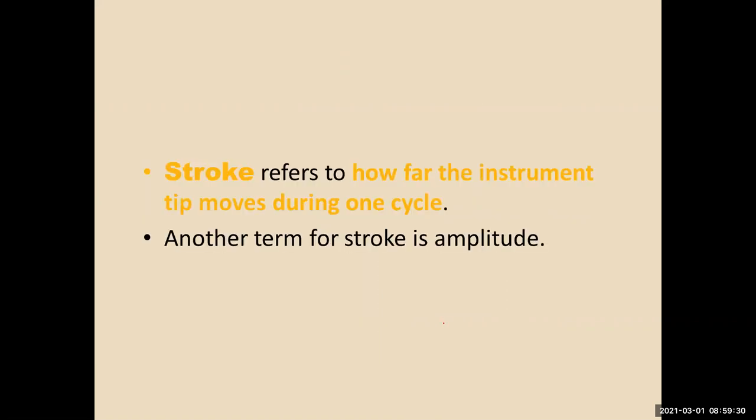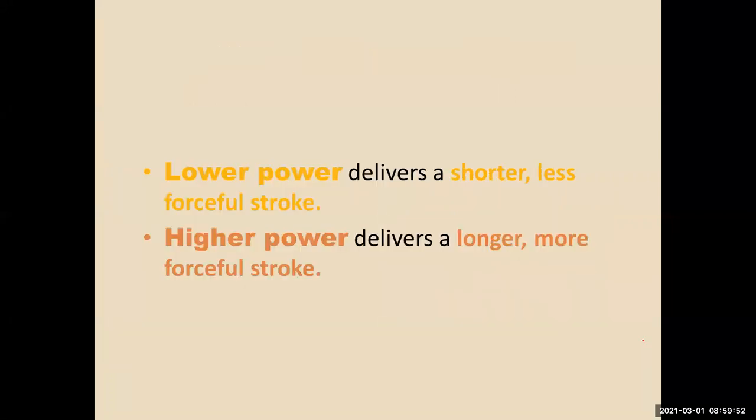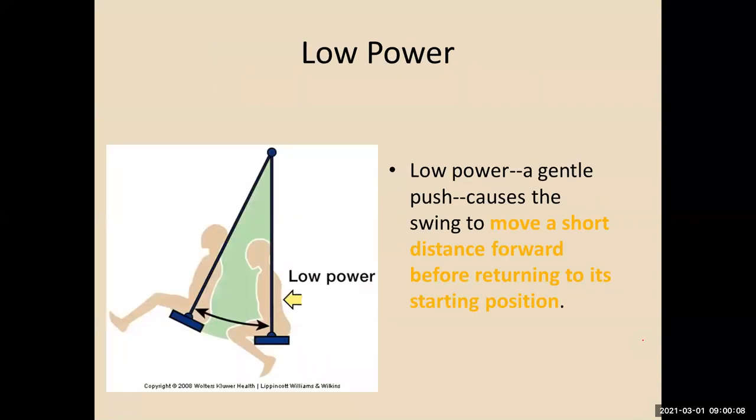Then the stroke refers to how far the instrument tip moves during one cycle. Another term for the stroke is amplitude. You've got a power knob used to change the length of the stroke. That is your percent. The lower power delivers a shorter, less forceful stroke. The higher power delivers a longer, more forceful stroke. Think about a parent pushing a swing. Low power versus high power. How far is that swing going?